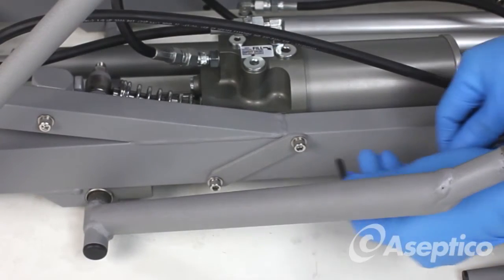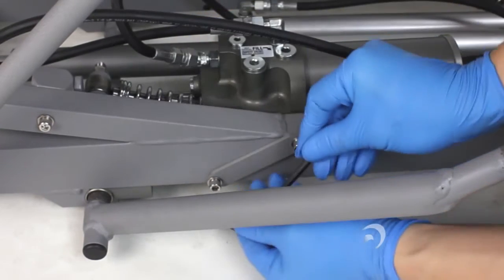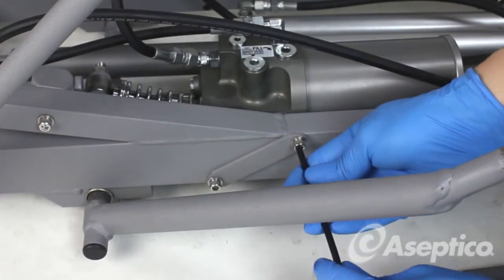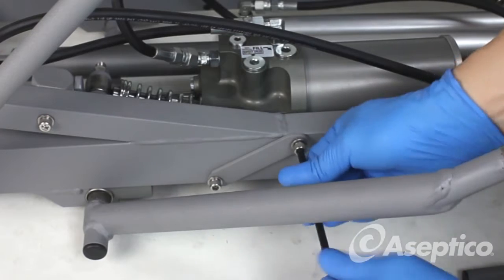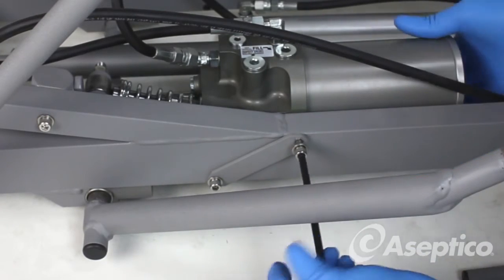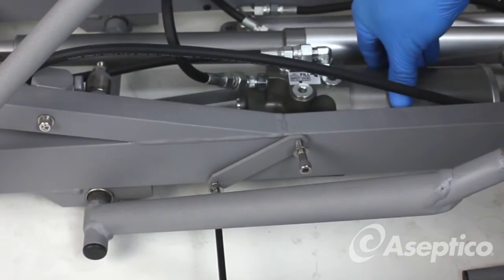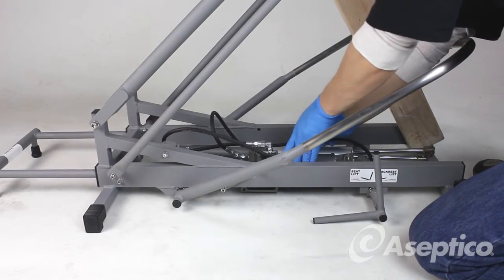Use a 3/16-inch Allen wrench to remove the pump bolts. Take care to hold the pump as it will drop to the floor once the bolts are released. Then take the hydraulic pump assembly out of the chair.